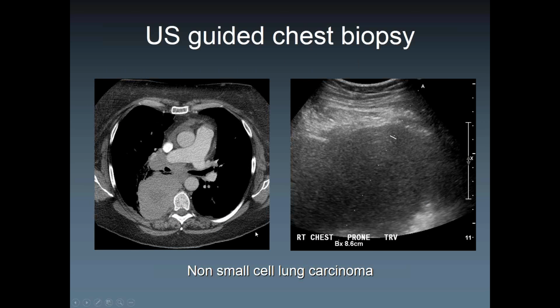And here it is. So it looks like a liver biopsy almost, right? You have solid tissue throughout. With ultrasound, very easy to see. And you can go straight in without causing any higher risk for pneumo or bleeding than it would be with a liver biopsy.